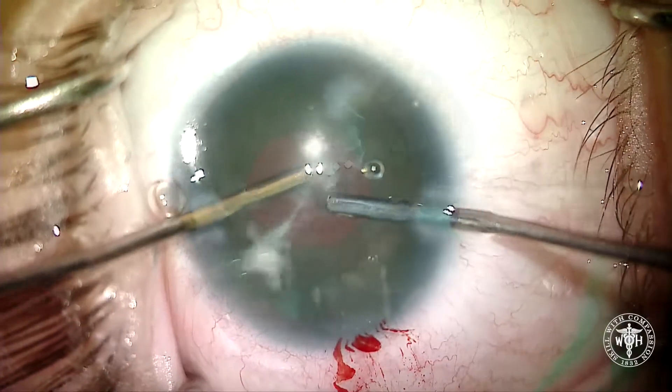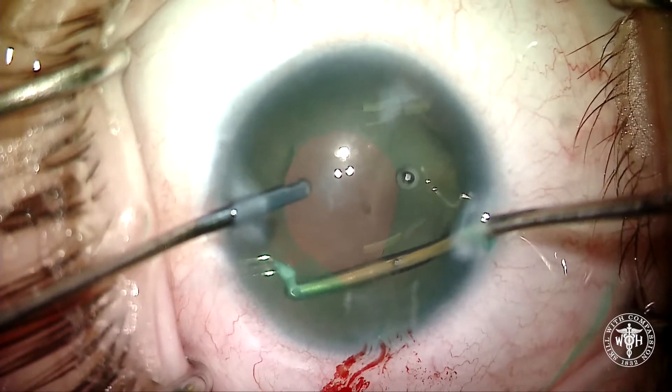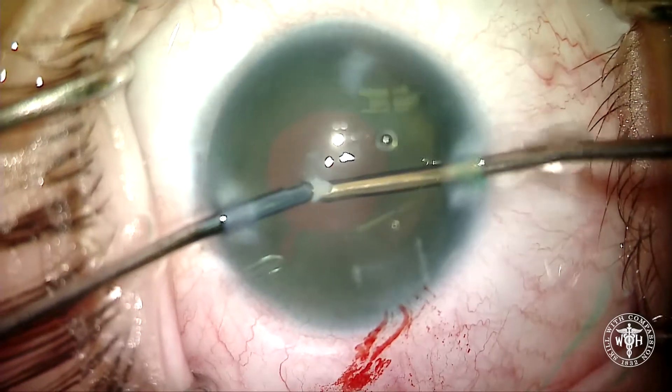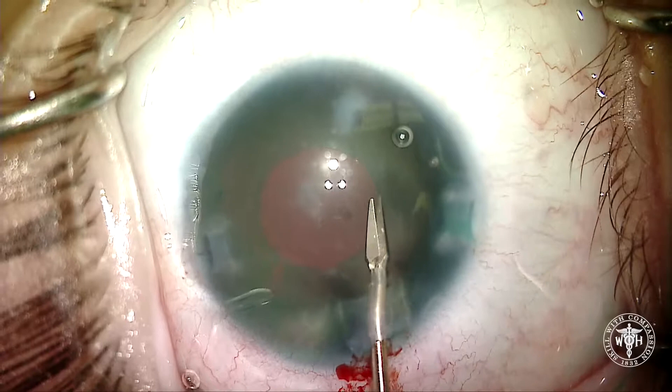Luckily it's relatively soft since she's so young — no phaco is needed at all. Here we are just aspirating off this little scar in the capsular bag, and you can see how it's just directly underneath where that tube shunt is. We couldn't really aspirate it, so we ended up just pulling it out of the eye with the aspirator.